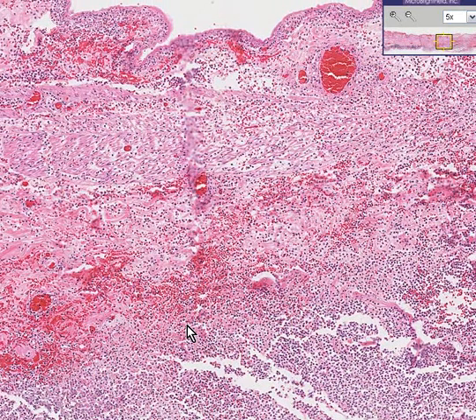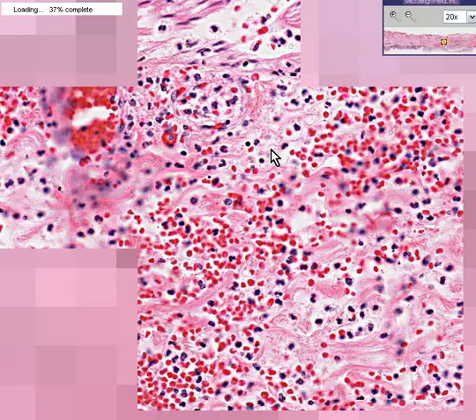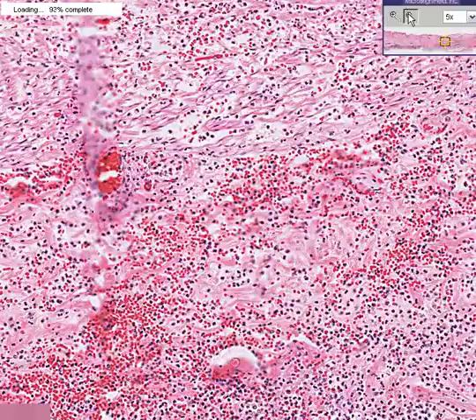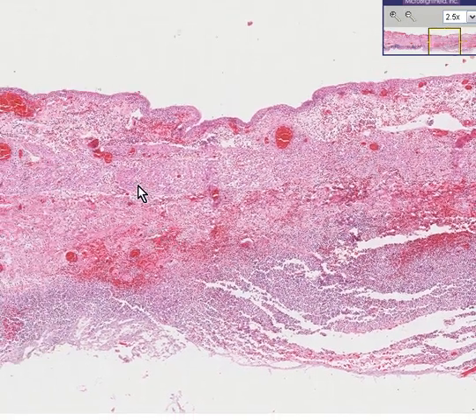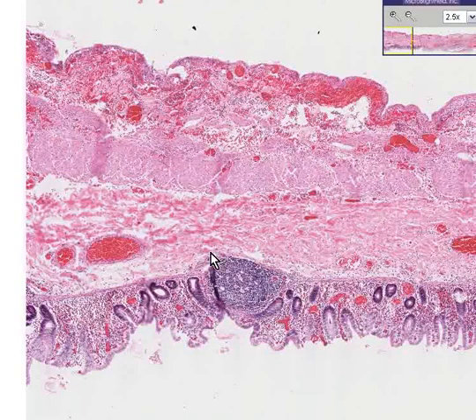You can also appreciate the fact that because of the infiltrate of all these inflammatory cells, probably chiefly neutrophils, but certainly I'm sure we could find some lymphocytes, the overall integrity and strength of the colonic wall would be compromised, and therefore infarcted colons are at risk for perforating, aren't they? Here is your classic hemorrhagic infarct of the colon compared to a relatively normal colon here.